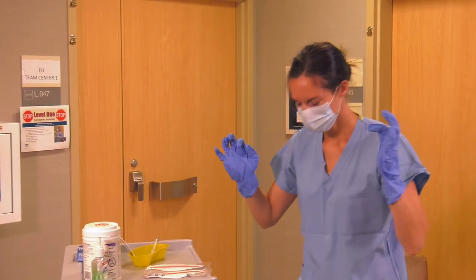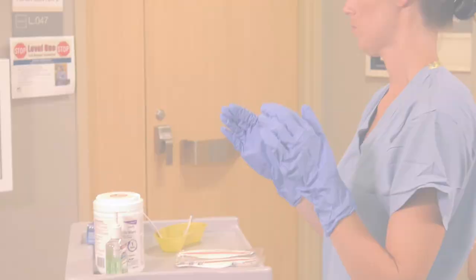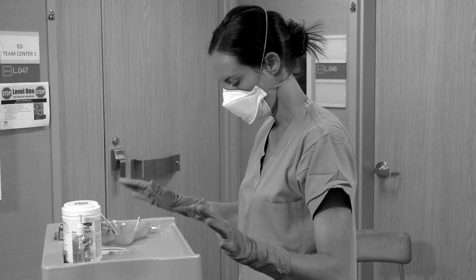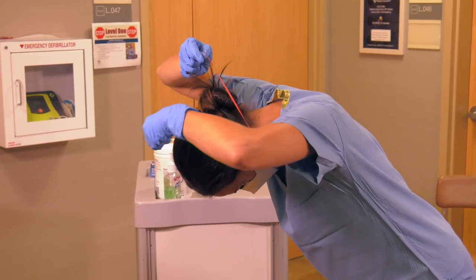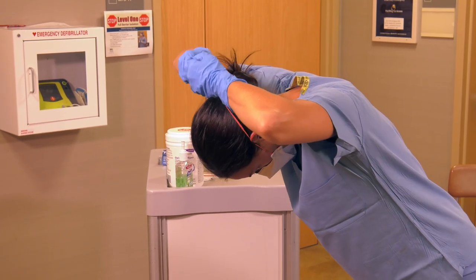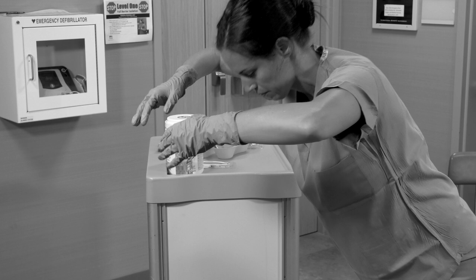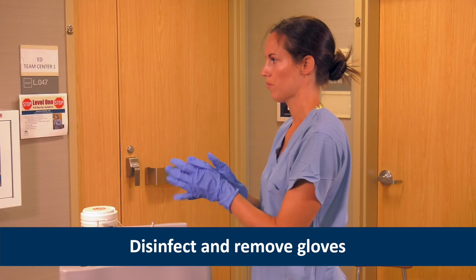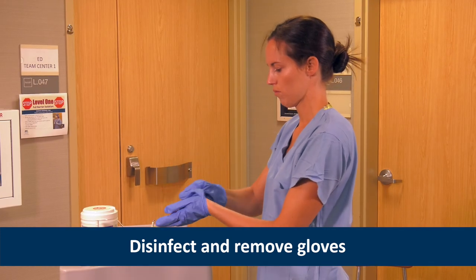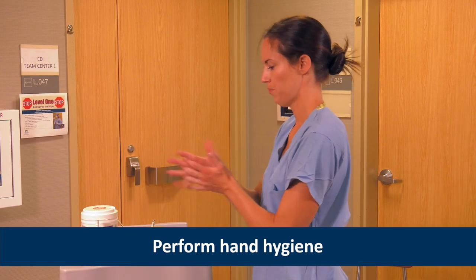Now, she removes the face mask, taking care not to touch the front of the mask or respirator. If Heather used an N95 respirator, she would remove it now by tilting the head forward, grasping the bottom elastic strap first, then the top elastic strap, and pulling them over her head. If she used a PAPR with a self-contained blower in the helmet, she would remove it now. Once the facial protection is removed, Heather disinfects and removes her gloves, and performs hand hygiene one final time.